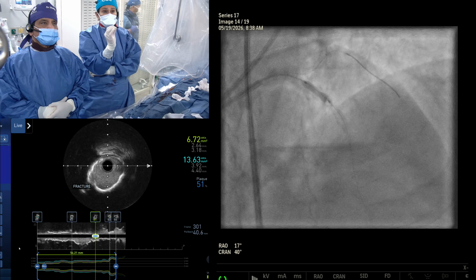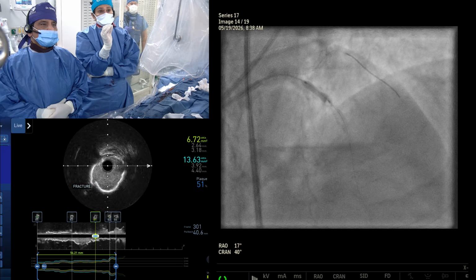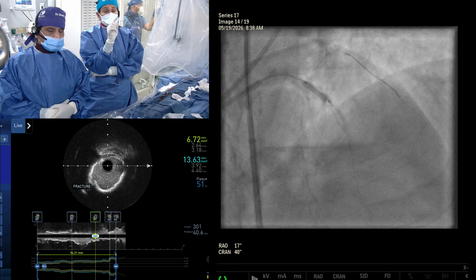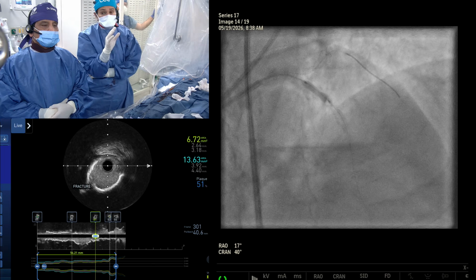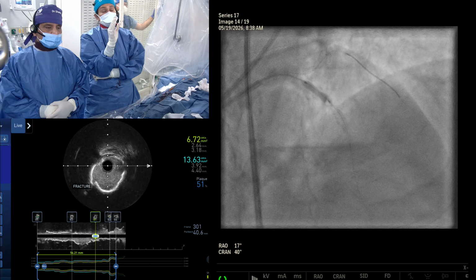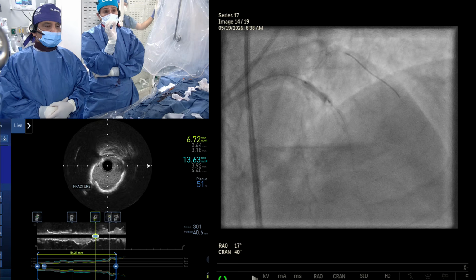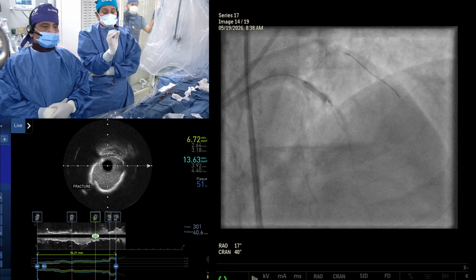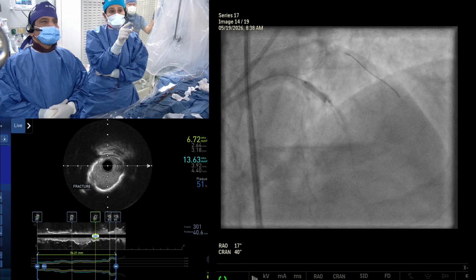And in fact, Kiski and I are trying to make this point: when you are using IVL and you have a calcified lesion, you got to use 1:1 if there is more than 180, almost 260, 280 to 360-degree calcium. Yes, that's very good. You can use 1:1. If it is less than 180, try to go with a smaller balloon. Yeah. So now go back there.